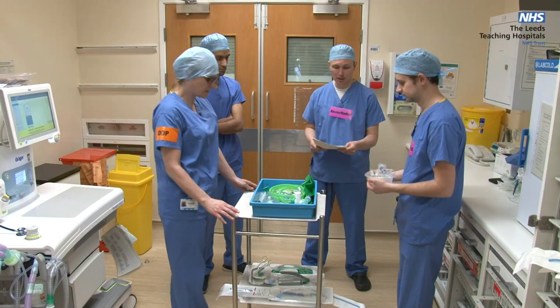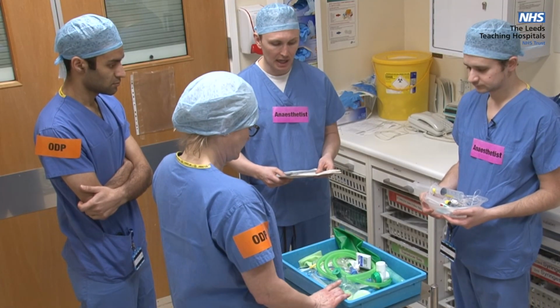So Dawn, can you check this with me? Yep. Face mask? Yep. OP airway? Yep.